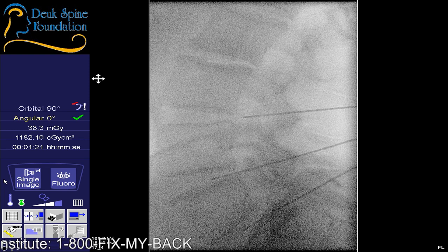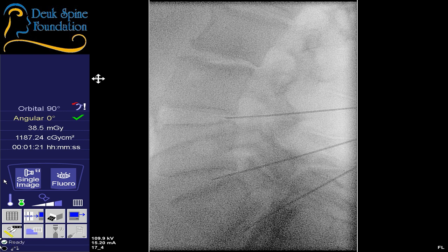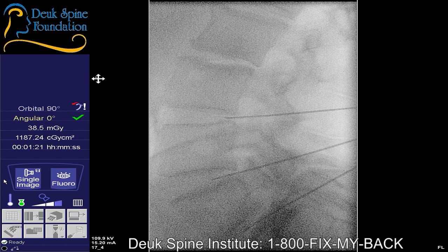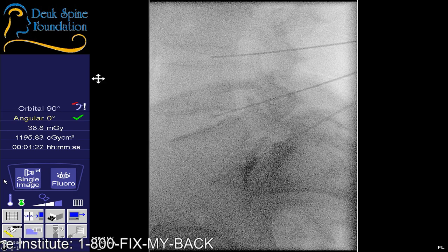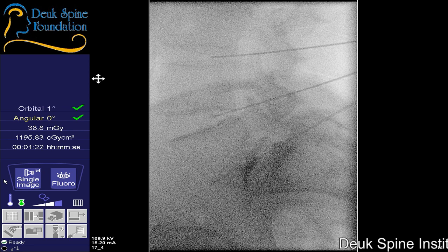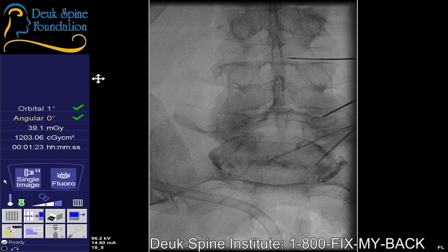Are you comfortable? Yeah. I need to see further down. AP. Are you pulsing? Just take it off pulse for a moment so we can get a nice clean picture. That's in the disc. You see that? You agree? Yeah. All right, let's go back to a lateral.